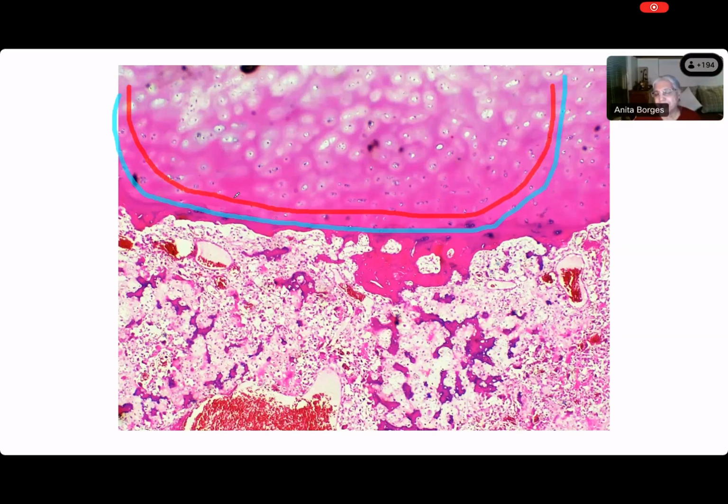What cap? Are we talking about an enchondroma? An osteochondroma which grows out of the bone and it has got a cartilaginous cap? Is that what you're talking about? We never saw any such thing here. All right. Do you want to see the gross appearance of this lesion? It's right there. The gross appearance.